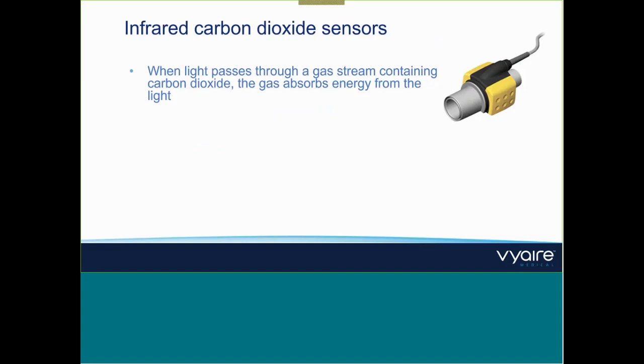So if you use mainstream capnography and you have the adapter there, I always hear that this adapter is sometimes used twice or maybe a bit more often, which you might imagine can also impair the effectiveness of the CO2 measurement, because these two optical filters, when they're somehow affected, for example, by nebulization, or there are scratches on it, or whatever could happen, the light source won't send the right signal anymore because it's impaired by maybe a defective adapter, and so you will get funny values.